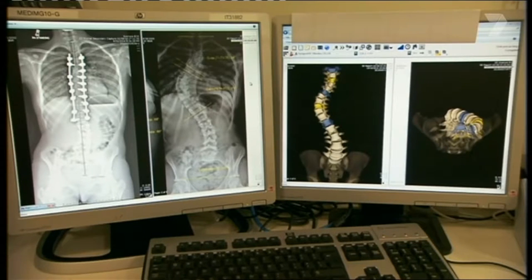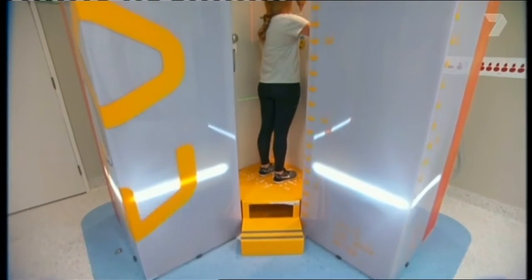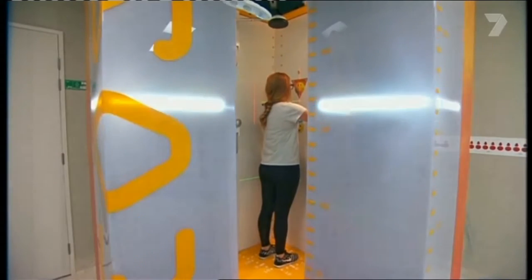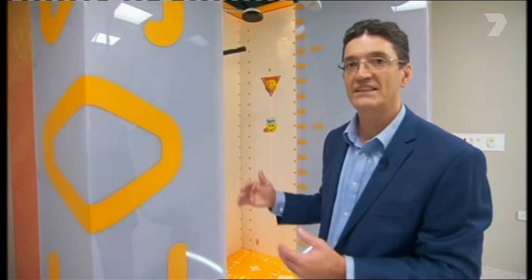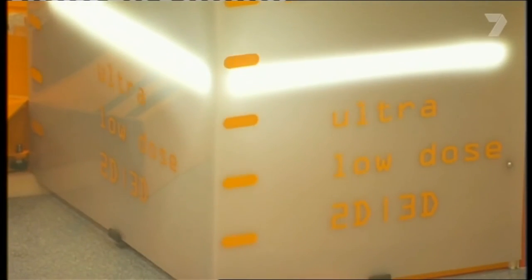What it does is it takes two beams of x-rays simultaneously. We're able to put that image together and create a three-dimensional picture of the shape of a spine or the shape of some legs. And the extra function that this enables us is to reduce the radiation dose to children.